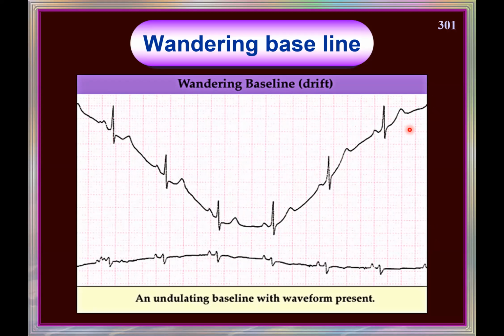What is it due to? It is due to improper contact of the leads. What you have to ensure is that the lead should be properly cleaned. The metal surfaces should not have any crusted old jelly and all that. Frequently, after every ECG, the metal parts of the lead should be properly cleaned. Also, if possible, you can wash the lead plates with detergent or something like tamarind.